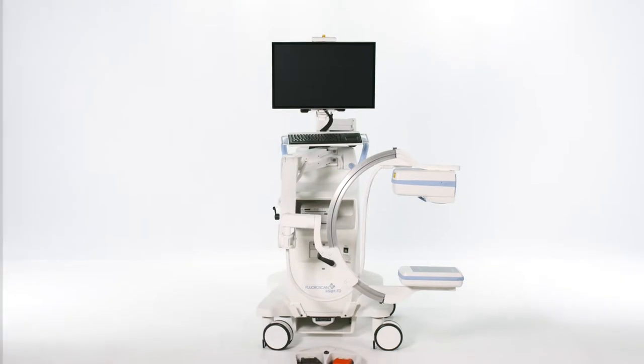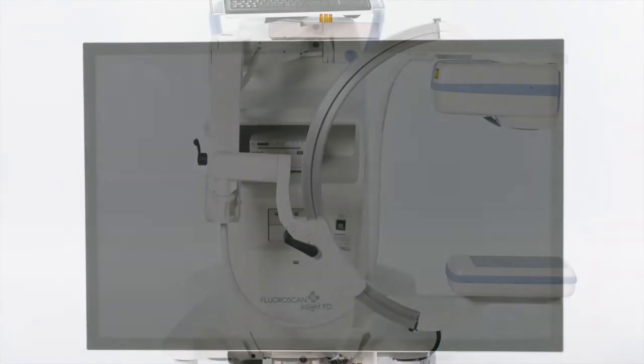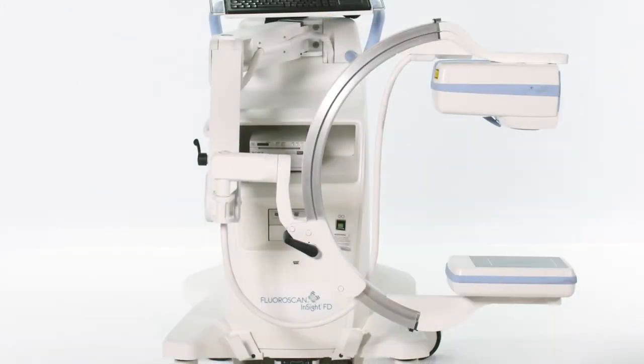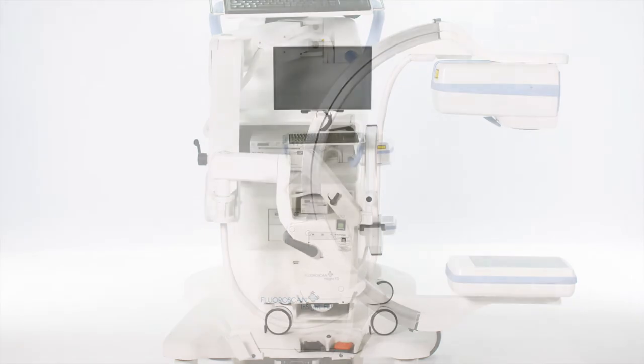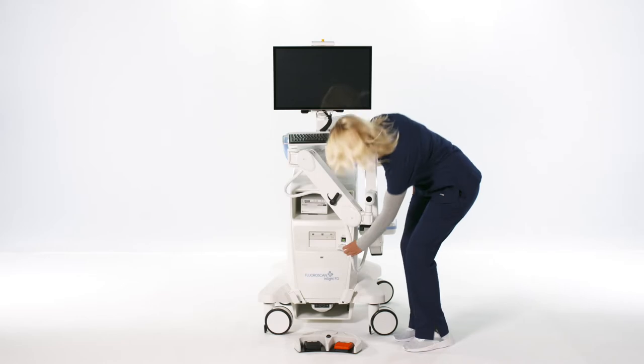The Fluoroscan Insight FD Mini C-Arm is designed to provide fluoroscopic visualization of patient extremities. The key components of the system are the monitor, the C-Arm, and the body. To start the system, press the system on switch at the bottom of the machine.